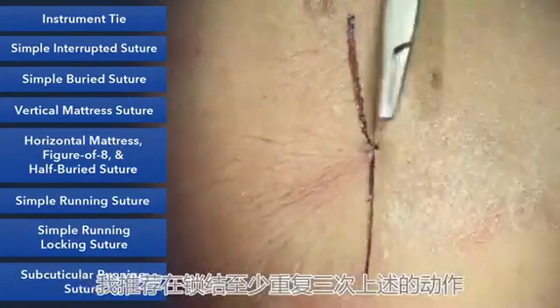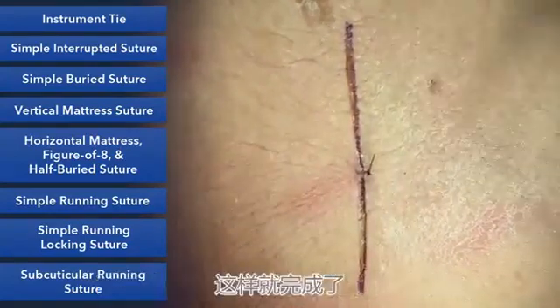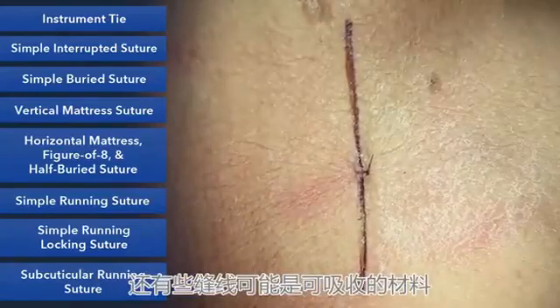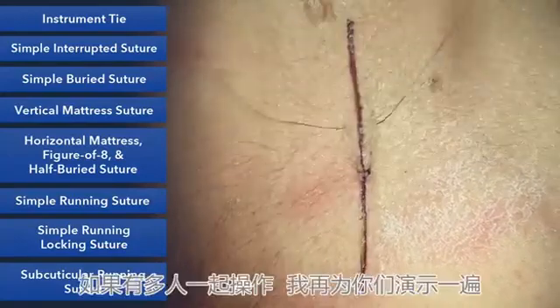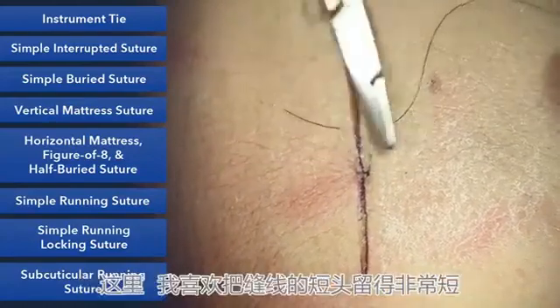I recommend at least 3 throws, instrument between, bring the small to the other side, and done. Some suture material you may need 4 throws, something maybe like an absorbable suture. But this is a very basic technique. It allows you to suture in a small place, so if multiple people are working, and we'll do one more for you right here. You can suture.